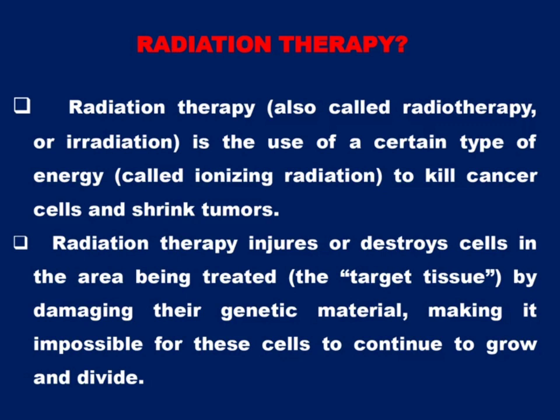A team of healthcare providers helps to plan and deliver radiation treatment to cancer patients, and treatment planning and simulation are an integral part of the radiation treatment delivery system. The goal of planning and simulation is to make the treatment more precise, more effective, more focused towards the tumor, and less damaging to the normal healthy tissues.